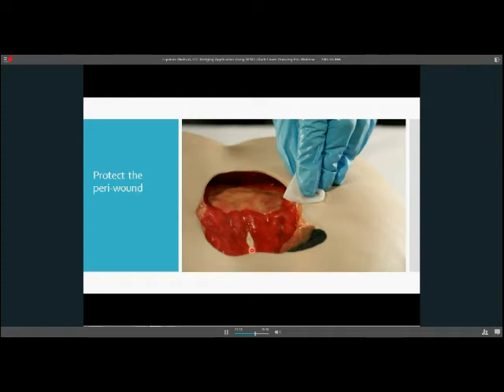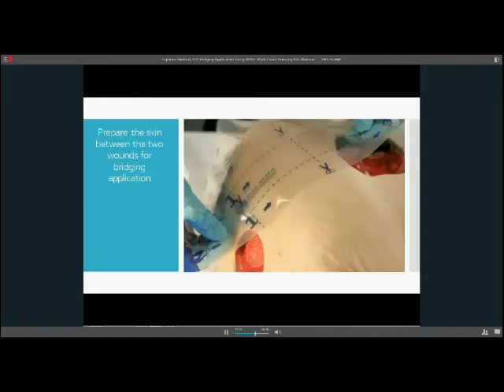For the sake of just letting you know, again, this is a wound butt, so this is what we had to work with. But of course, we see here that bone is exposed, so we would be protecting that bone. We would be making sure that there is not osteomyelitis in the wound bed, and if there was, we would treat that. In this area, of course, would not be included. We would worry about that as having eschar. But we'll make believe that this isn't here for now.